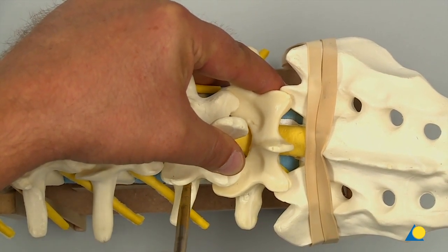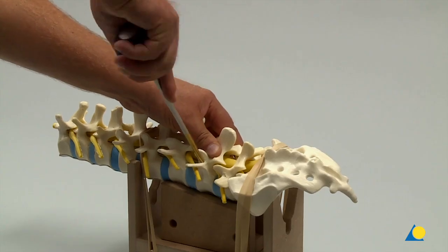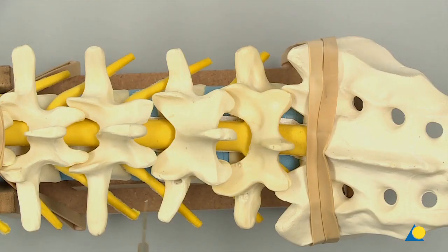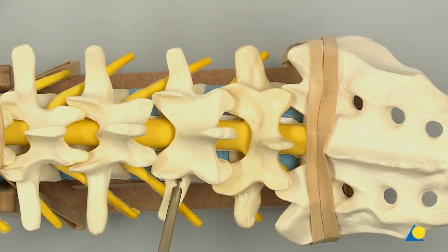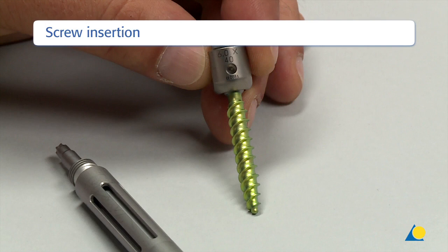To increase stability when the bone of the sacrum is osteoporotic, bicortical screw placement can be considered. The screw length is measured using the depth gauge. Polyaxial screws have a fully threaded tapered tip, minimising the need to tap. However, taps are provided for surgeon preference.